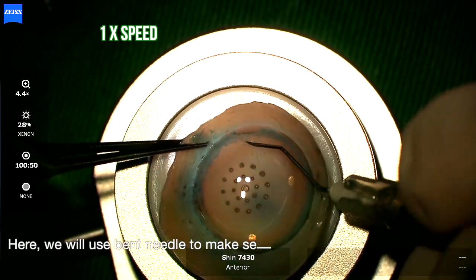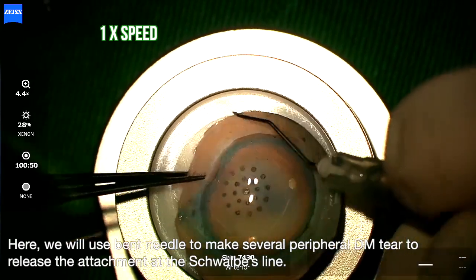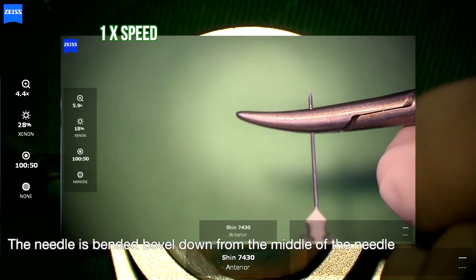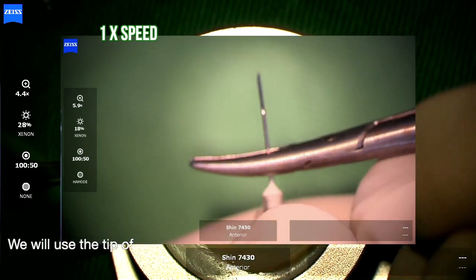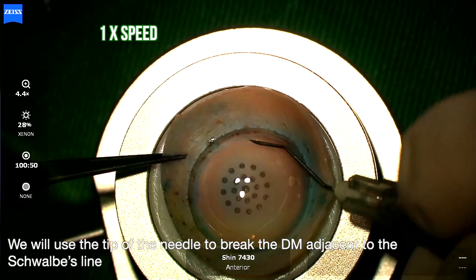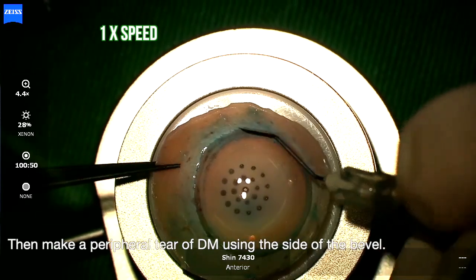Here, we will use a bent needle to make several peripheral Descemet membrane tears to release the attachment at Schwalbe's line. The needle is bent bevel down from the middle of the needle and then bent upward at the base. We will use the tip of the needle to break the Descemet membrane adjacent to Schwalbe's line, then make a peripheral tear of Descemet membrane using the side of the bevel.